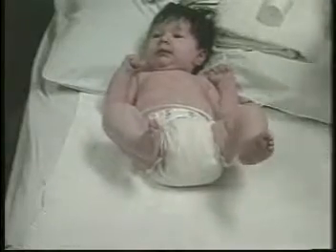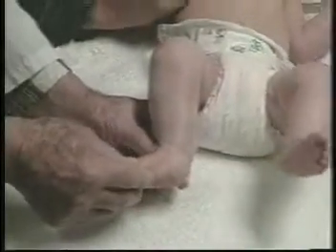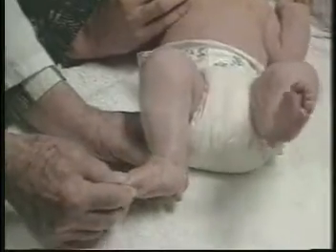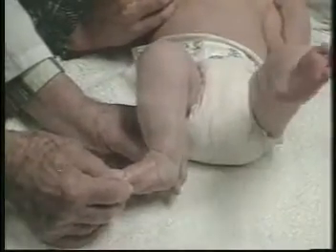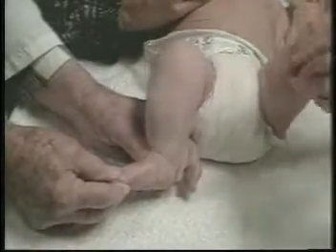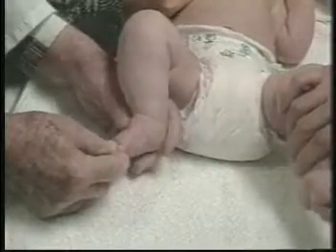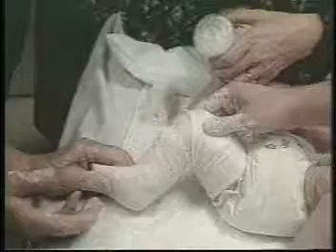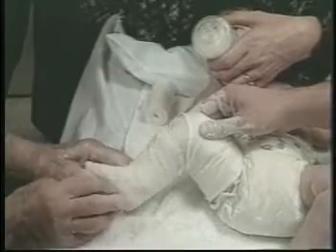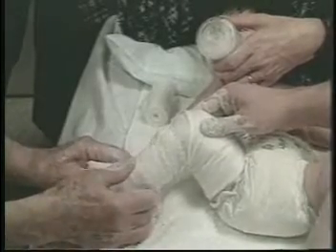Five days later, after the third casts are removed, the feet are quite improved. Again, the feet are abducted in some supination, placing the thumb over the head of the talos. Now, the fourth casts are applied holding the feet in 30 degrees of abduction. The legs are not externally rotated.